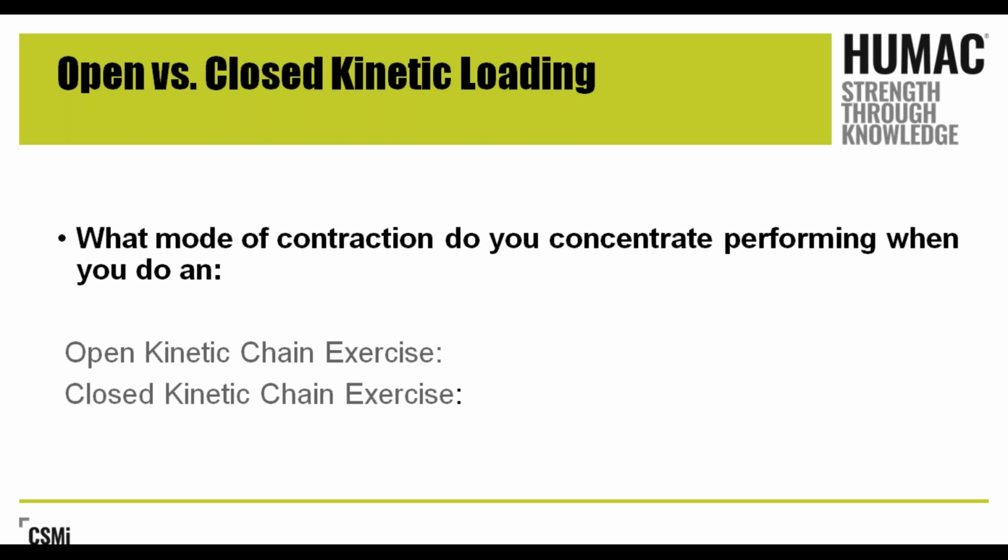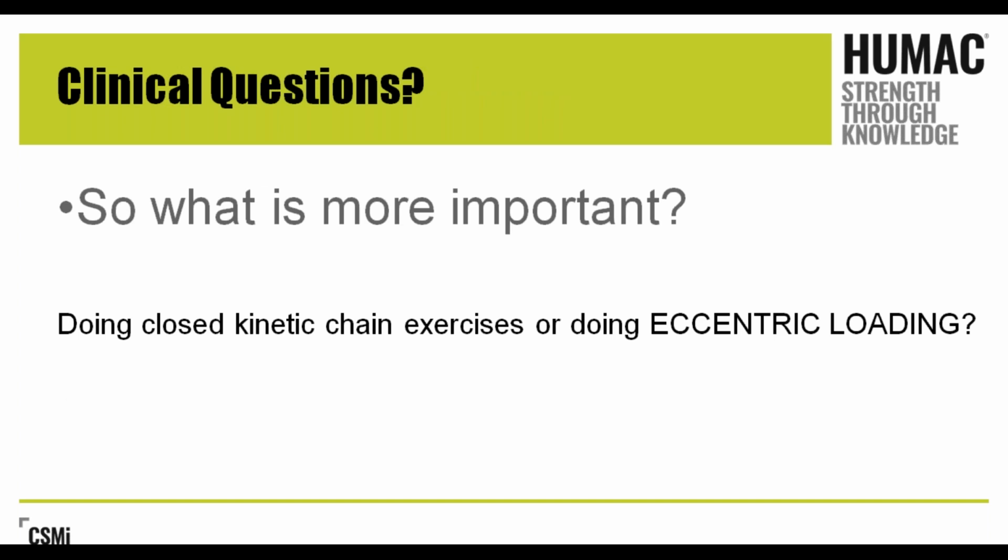So my question is really going to be, what's more important? Is it that we were concentrating during that closed kinetic chain exercise on the eccentric mode of contraction, and that happens to be what the deficit was with our training program? And if that's the case, can we do eccentric loading appropriately in both open and closed kinetic chain exercises? And the answer to that resoundingly is yes, we can.